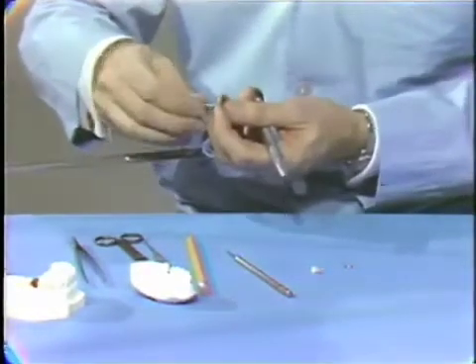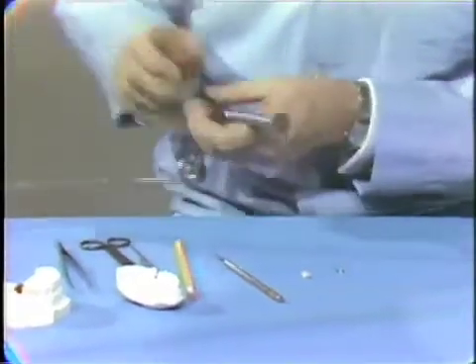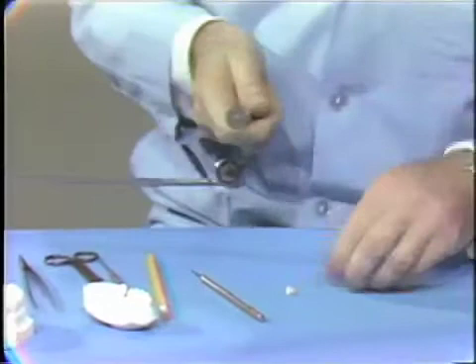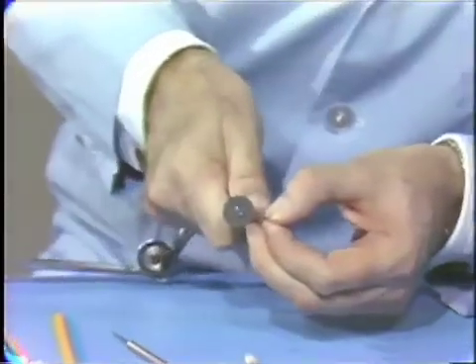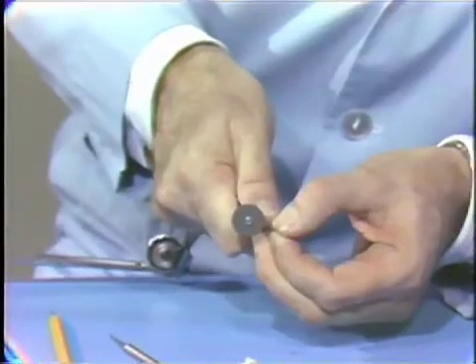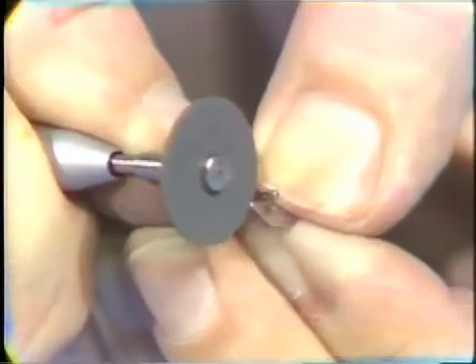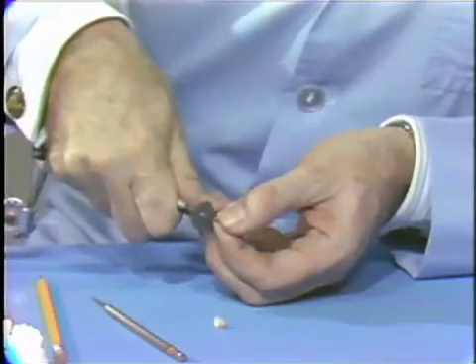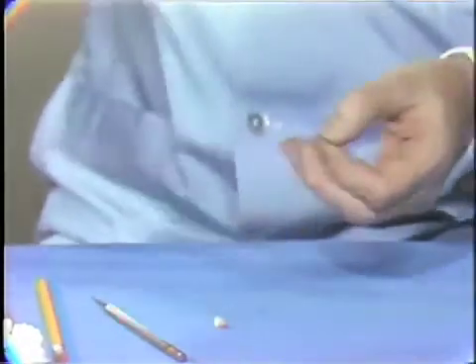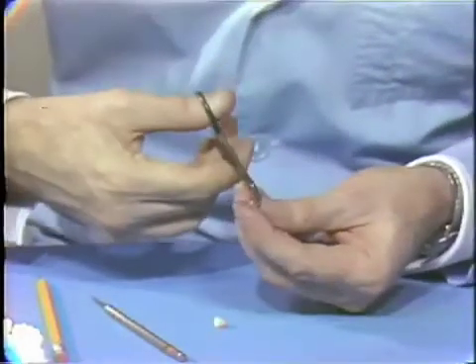Here's a Joe Dandy disc which we'll put in our handpiece, and I'll show you the means of making that little cut in at the angle there. If your crown shears won't cut right into there, take the Joe Dandy and just cut in at that angle up to the line that you have marked. So, and the same on this other side. And then take the scissors and continue the cut.